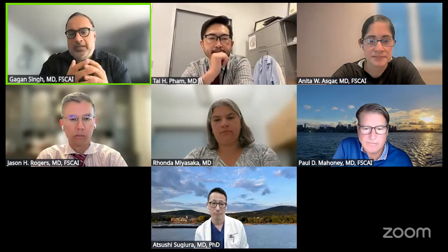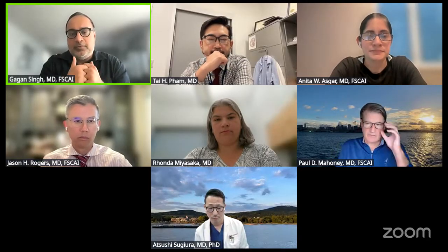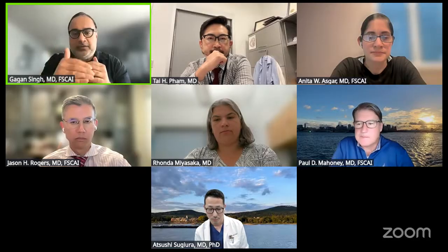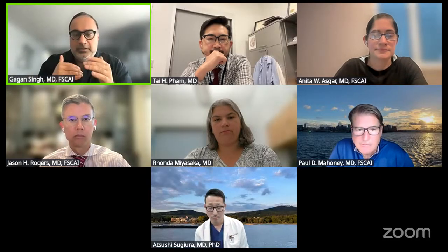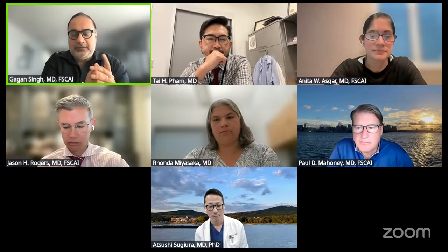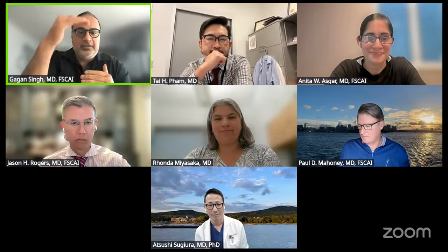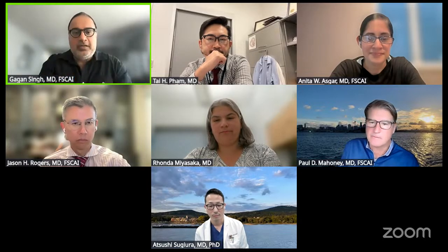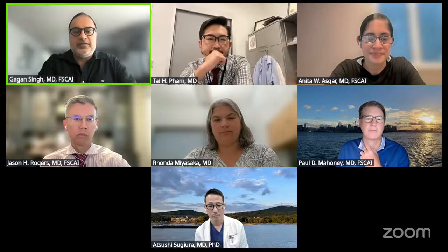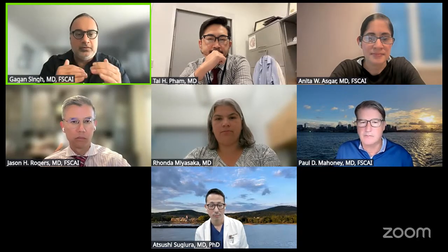In my own personal experience, I find the Clover technique to be a little bit more unpredictable in terms of whether you're going to have acute and durable TR reduction. The zipping technique seems to do more. Actually, Philip Lurs was doing a live case at New York Valves. For sure, I thought he was going to do a Clover technique, and all of a sudden he ended up zipping. So I think that paradigm is changing a little bit about the Clover technique as the primary approach. It's shifting a little bit back towards zipping.